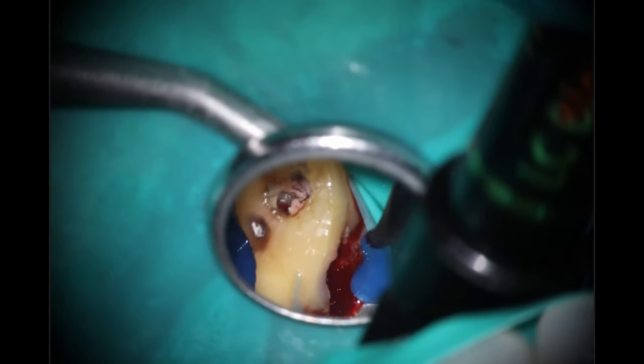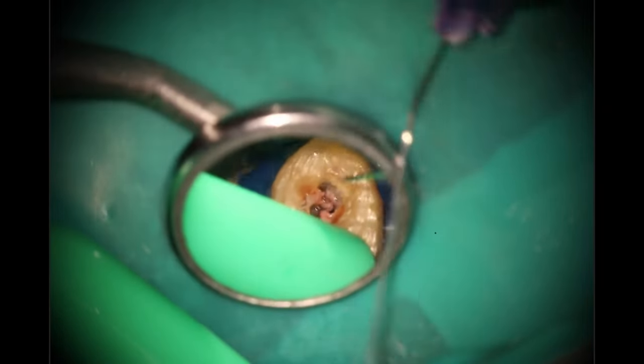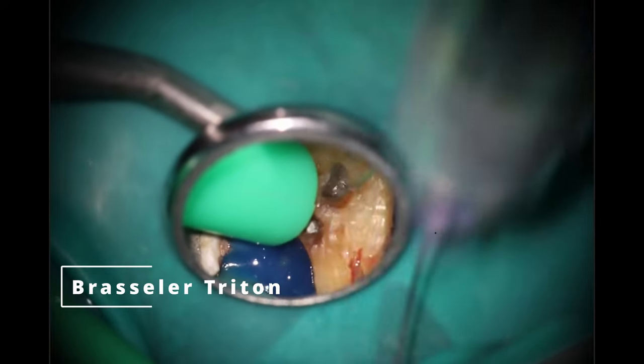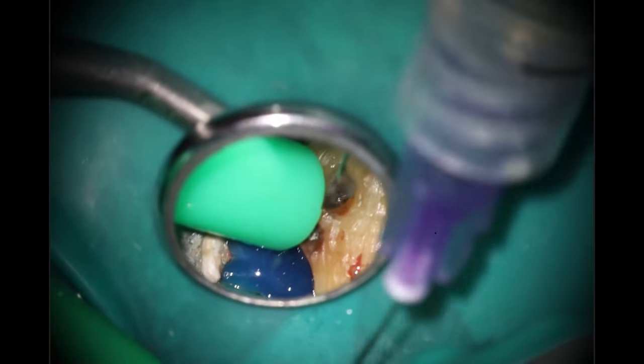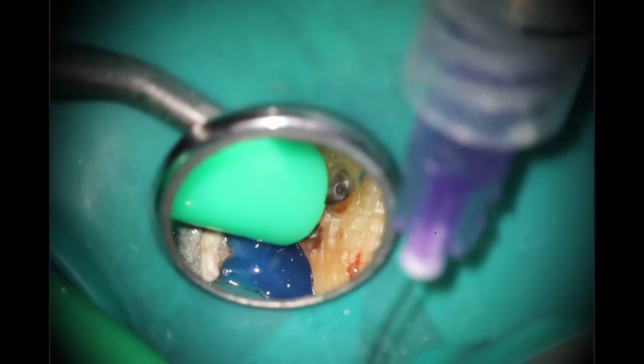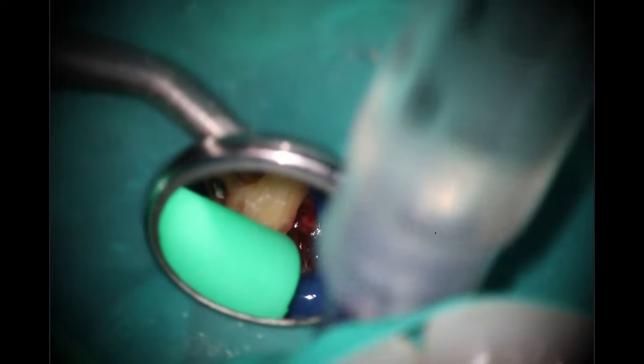It works really nicely because you can light cure it. We'll speed this up — no one really cares about the light cure process — 20 seconds, and you have a good seal so you don't have to worry about when you're rinsing any getting inside the mouth. Because I don't care how good you are with rubber dams, it's going to be very difficult to get a good seal on a tooth that's rotated like this with such limited access. So rinsing out here with Triton — still loving that stuff. It works better than the regular bleach and EDTA combination in my hands.